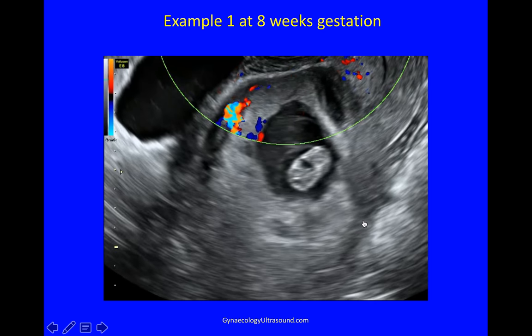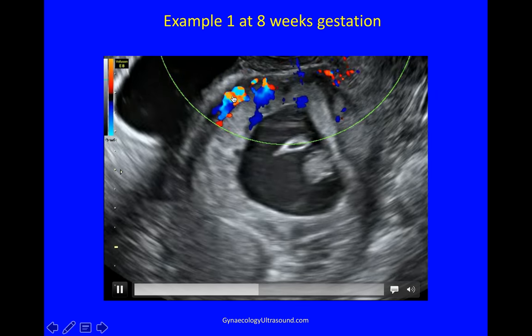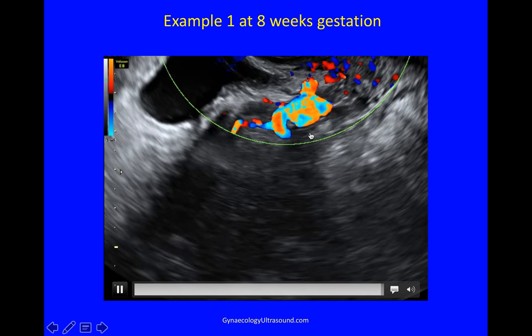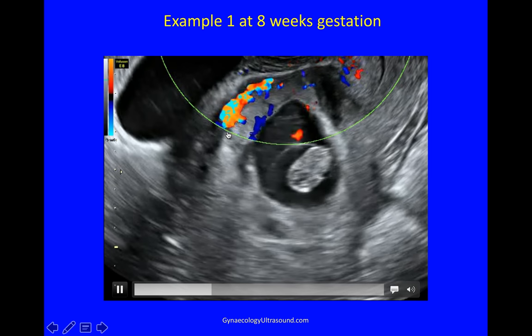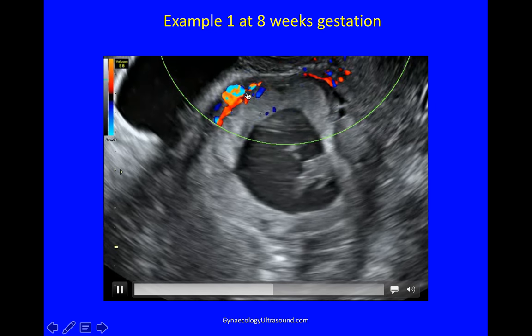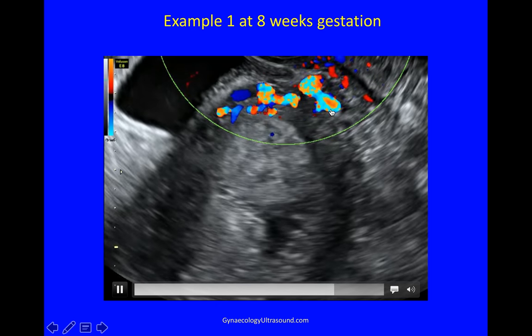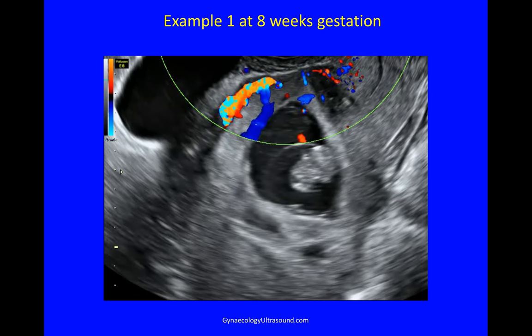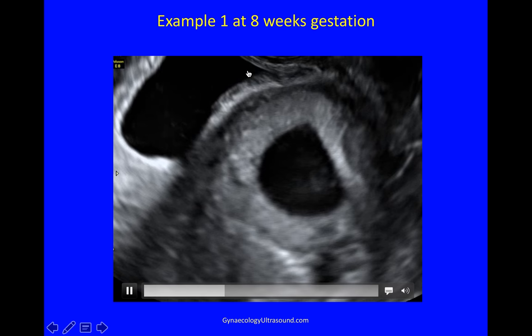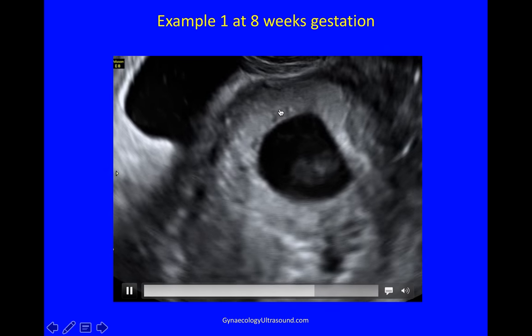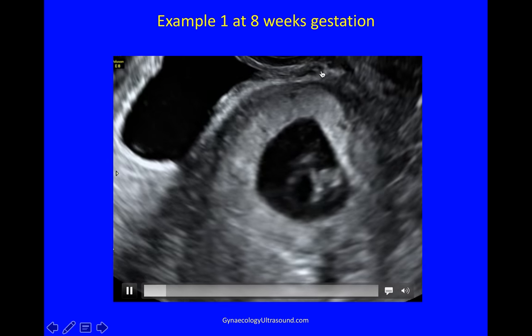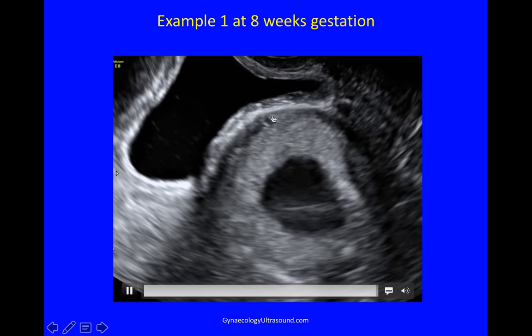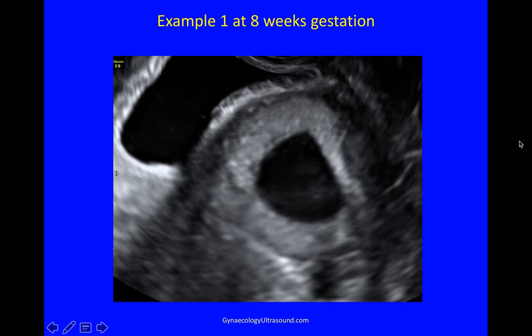Here you can see the vascularity with colour Doppler applied. These are the abnormal vessels from the trophoblast — because the niche is relatively hypoxic, these vessels invade looking for a better blood supply than they can get from the scar tissue — and you can see very strong vascularity, confirming this is embedded within the niche and not part of a miscarriage. When assessing whether vessels are crossing over into the bladder serosa or mucosa, you can see here a normal sliding sign where the bladder is moving normally on the anterior uterus, and the vessels do not cross into the bladder.